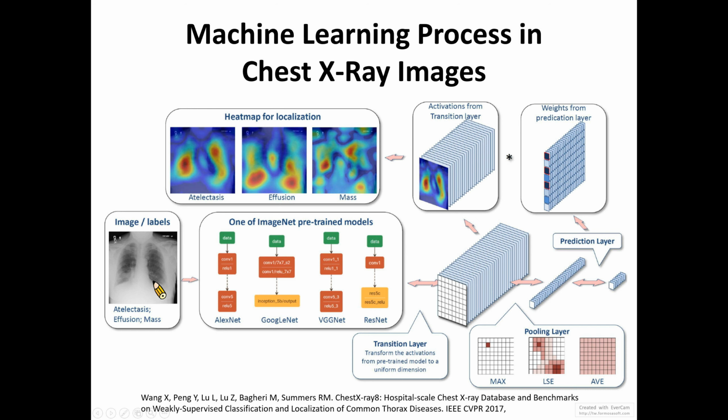For any chest X-ray images, this uses the concept of transfer learning. Then we use the pre-trained models, for example, AlexNet, GoogleNet, VGGNet, or ResNet.